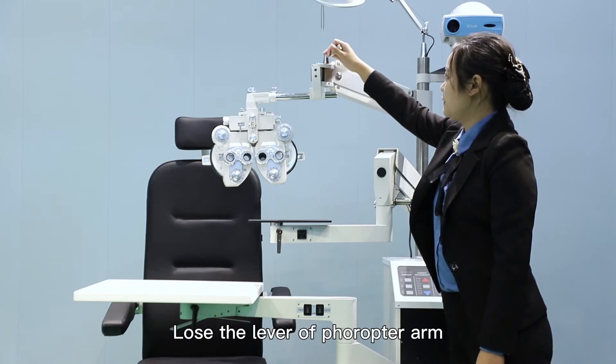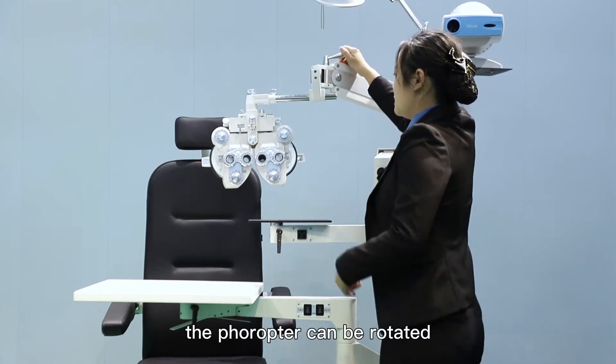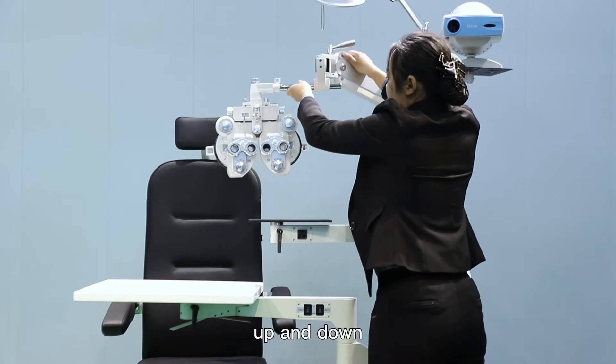Loosen the lever of the phoropter arm. The phoropter can be rotated up and down.